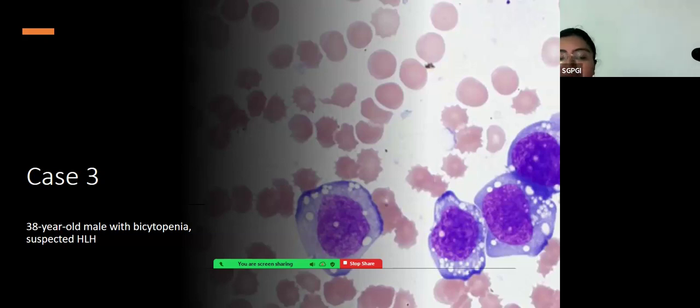Case 3 was a 38-year-old male with bicytopenia suspected HLH. You have cells on the right. What do these cells look like? These cells are large cells, very large cells, abnormal cells. They have vacuolation and they are sort of sticking together as well. That is the morphology of these cells.